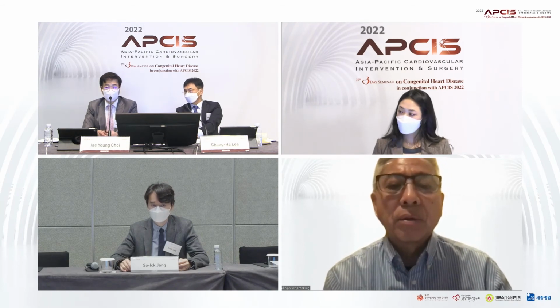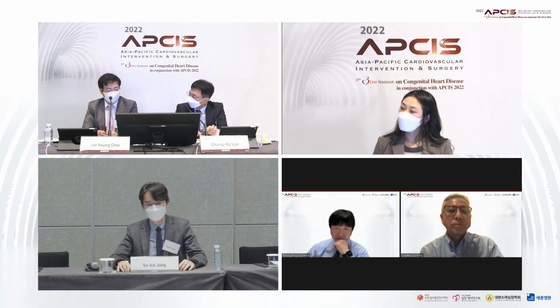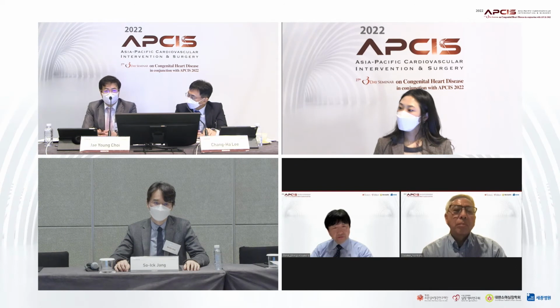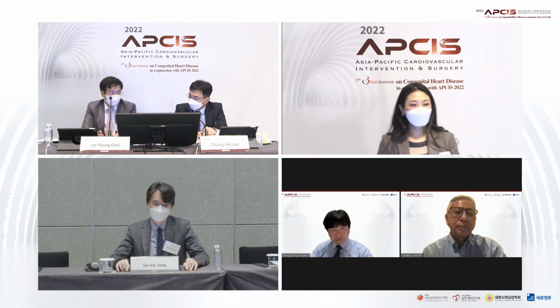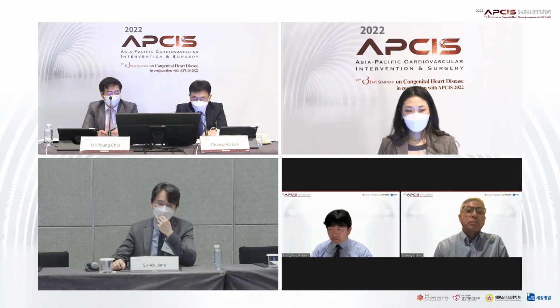However, very rarely, some patients show peripheral pulmonary stenosis that does not respond to any treatment. I have experienced 2 such cases in my life: stenting, balloon, cutting balloon angioplasty, high pressure balloon angioplasty, any kind of intervention didn't work, and it progressed to severe intrapulmonary stenosis.